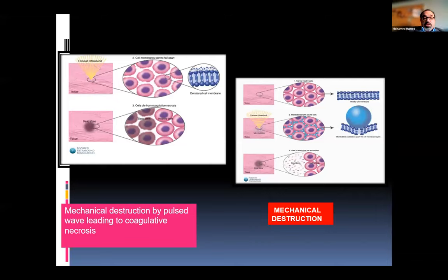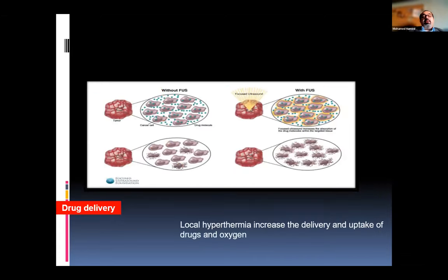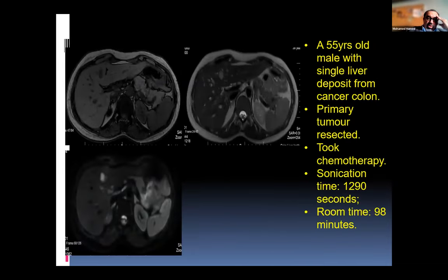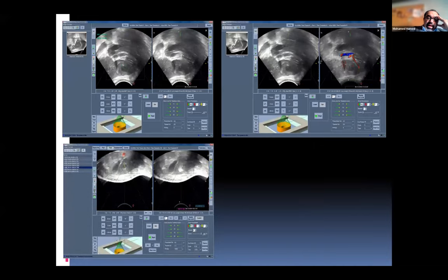Regarding the metastatic lesion, it's another issue. We must introduce HIFU, like Professor Vidal talked about, with immunomodulation and immune response, because HIFU is not only mechanical destruction of the lesion, but it also improves drug delivery and improves the immunotherapy of the patient and alters the nature of the tumor. And you can see, of course, all of you have very good results with these small metastatic lesions, very easy, very accessible.